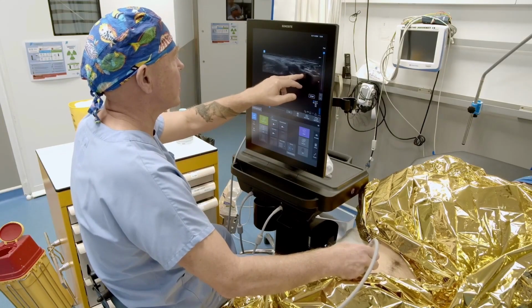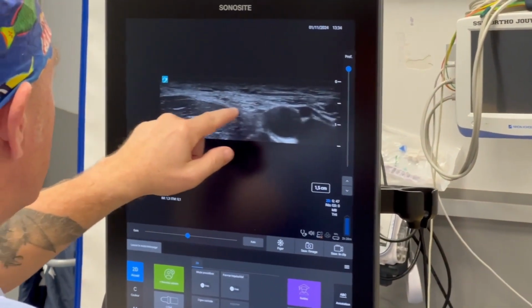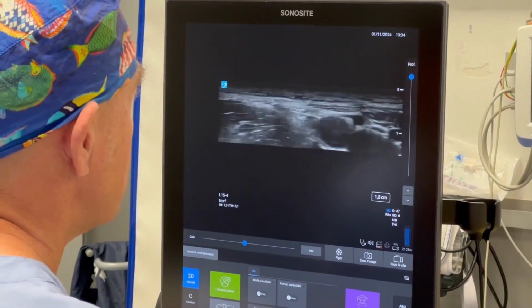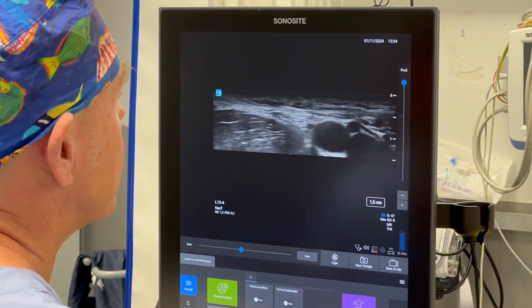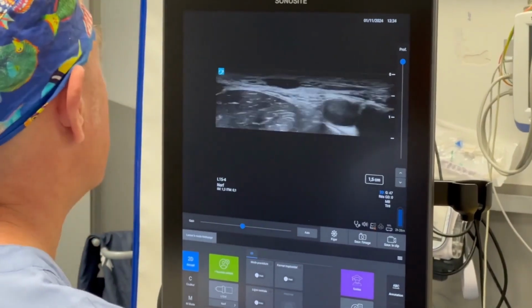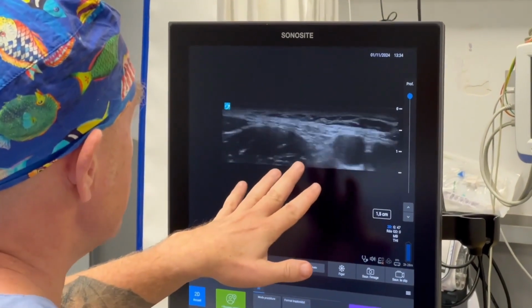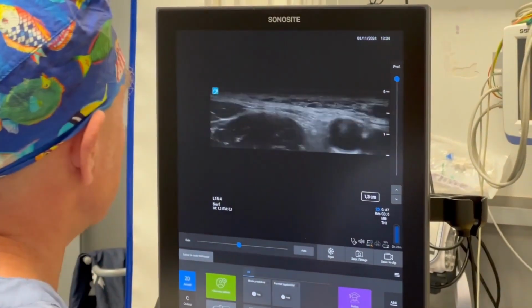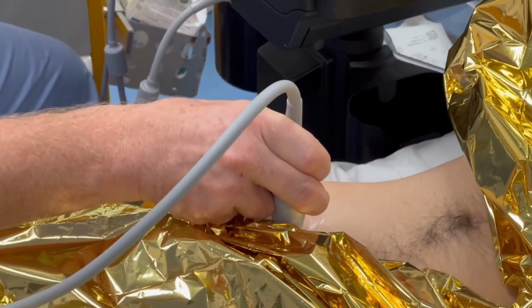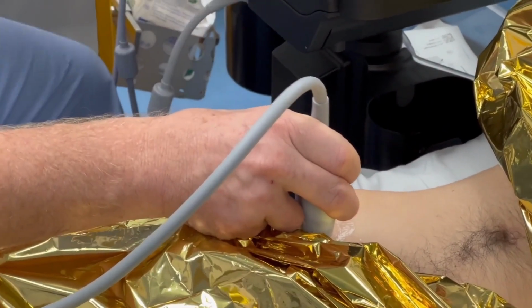You can see here, right next to it, the vein, which I forgot to draw earlier, and right next to that, the femoral nerve here. So there you have it. This is one of the simplest blocks. This is something you can do at a beginner level, but of course, once you master the visualization, here you see a slightly better image. When you're steady and have the right view, don't hesitate to make small tilting or slight rotational movements to optimize it. And then bring your puncture point a bit closer, just like we saw, by translating your hand.